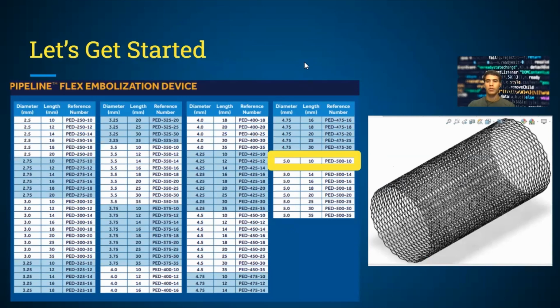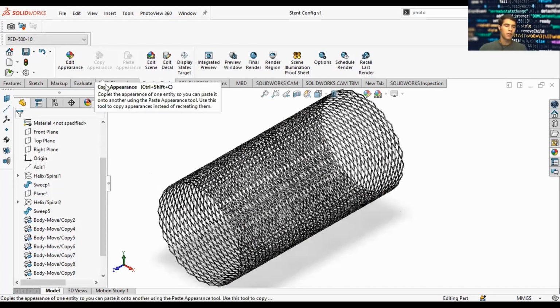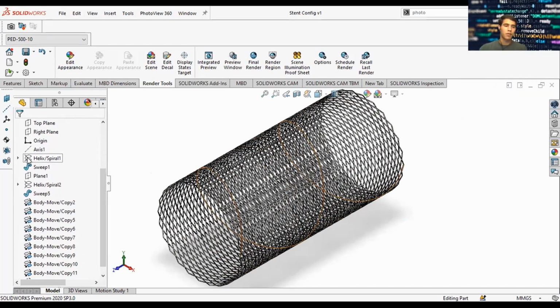From there, I'm going to jump onto SolidWorks. Here we're on SolidWorks, and this is how the part looks. To give you a layout of SolidWorks, here on the left we have a family tree. Whenever you make a feature, it's going to list that feature. The first thing we started with here was the axis. If we go all the way to the beginning, you can see the history of the entire part as it was made from top to bottom.